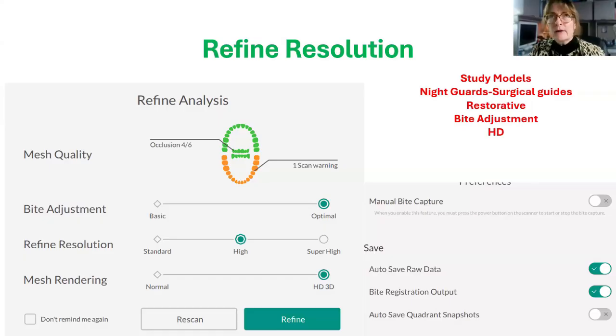Yes. And do you have a recommendation with this particular software, whether to have the patient in a more upright position or laying back in the dental chair? You know, I hear a lot of schools of thought, but me traditionally, when we get the bite, they're sitting up still, right? They're still sitting up. So we tend to collect it in the upright position. But I do have clinicians who do it laying down. That's my favorite as well.